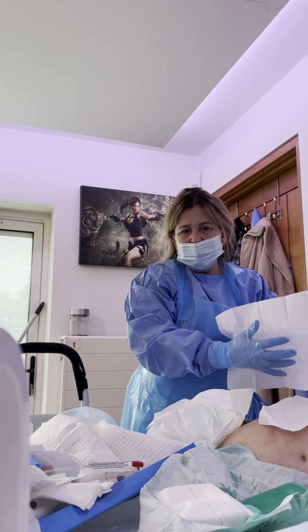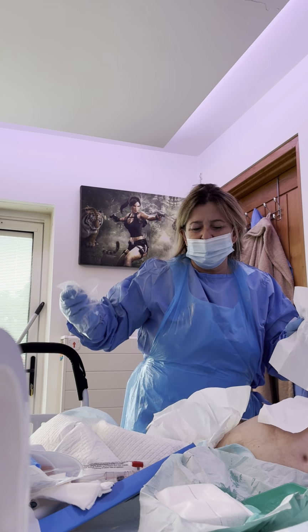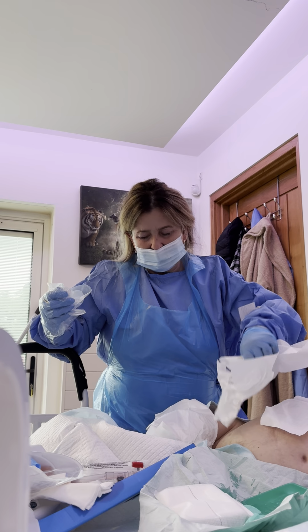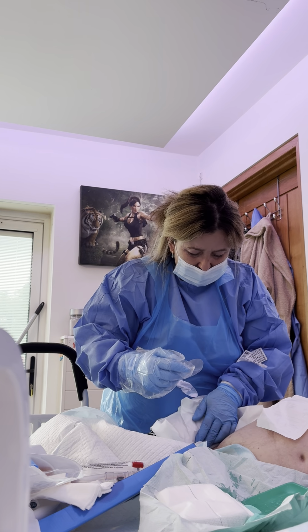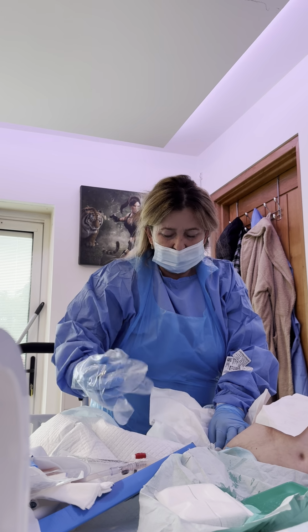I believe you might need a cystoscopy, which is a camera and a flush inside. Yeah, well, I haven't had one. No, he hasn't had one of those for a long time. So, I'm just making sure that that's in situ still. Did you blow it up? Not yet, I'm making sure it's there. Okay. Just right there, that's fine. My AD bit went through the roof a little bit there.